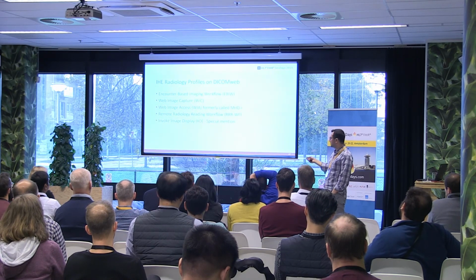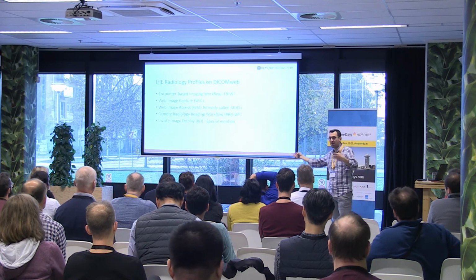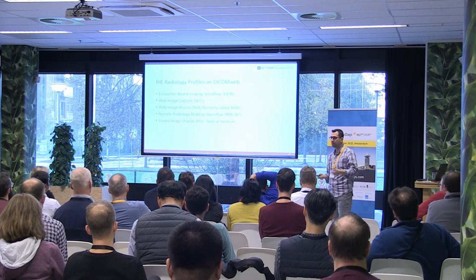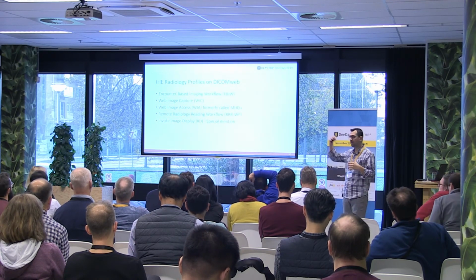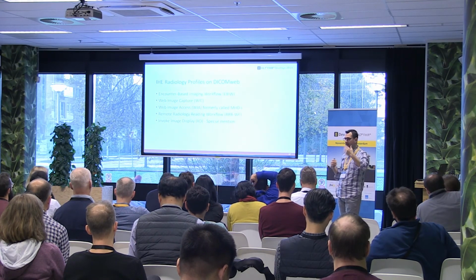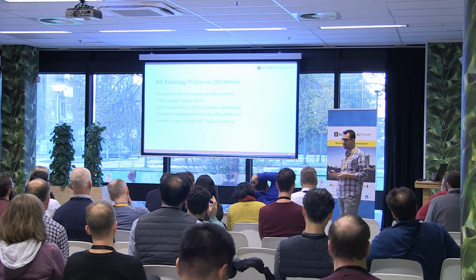Remote radiology reading workflow is one where radiologists could be essentially working from home and be able to still do the work they need to do. Now, it's not so much about working from home, but think about remote areas. I don't know, somebody in the North Pole and the radiologist is far away reading their images. Okay.